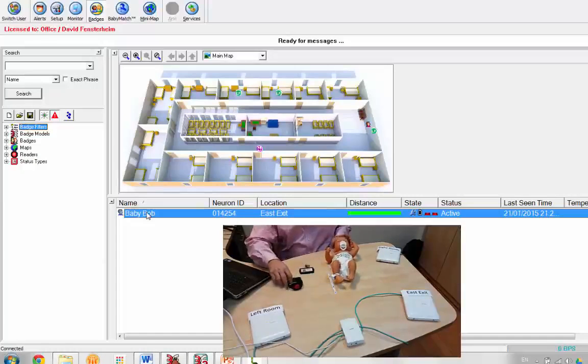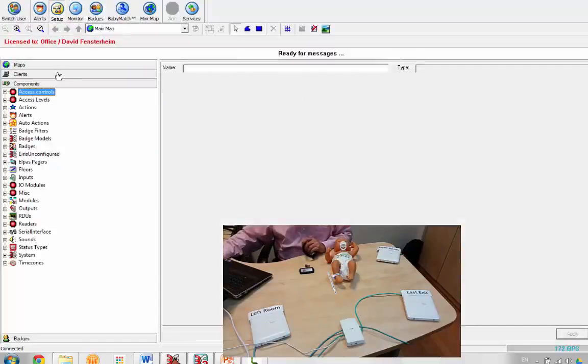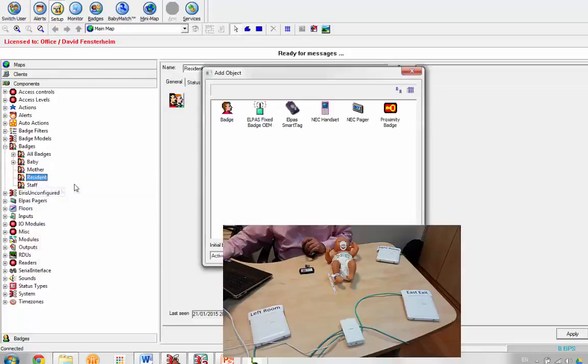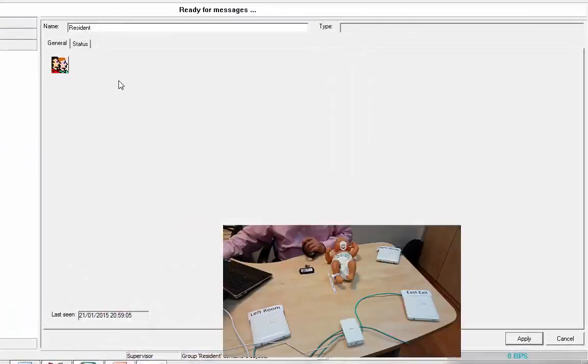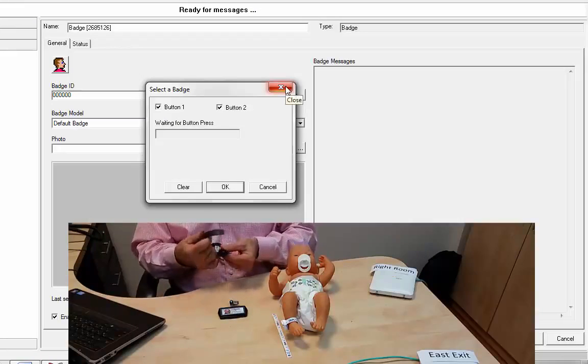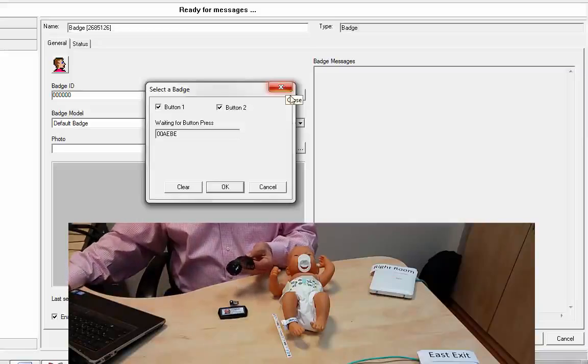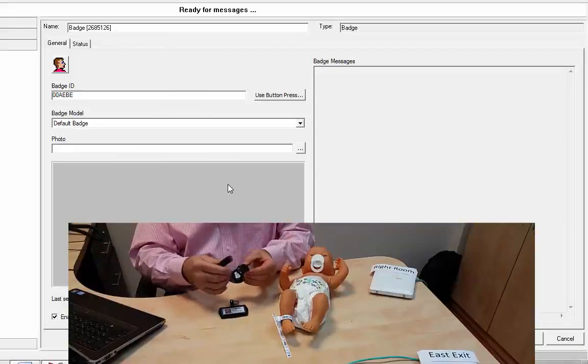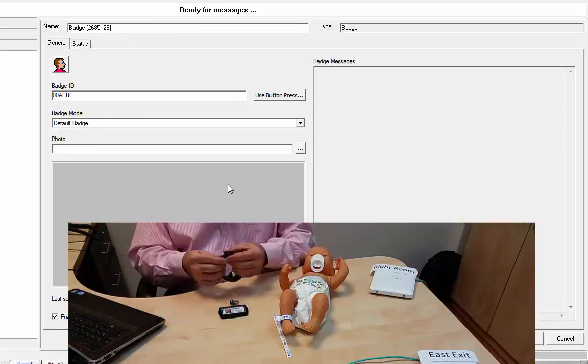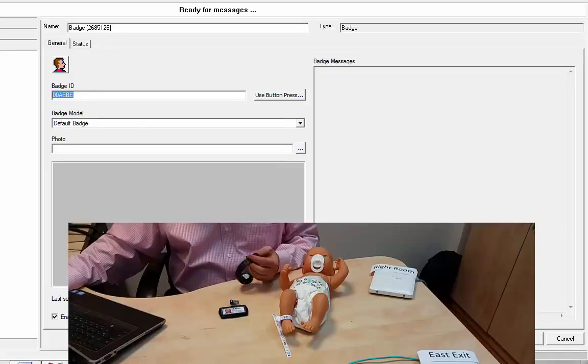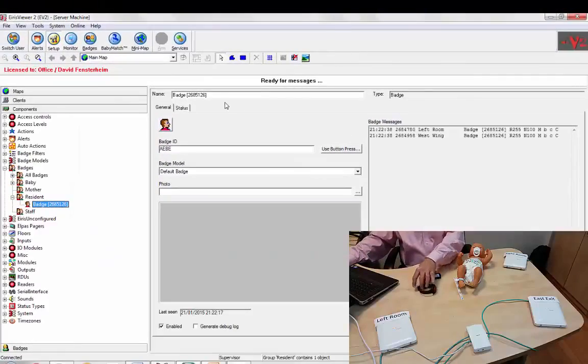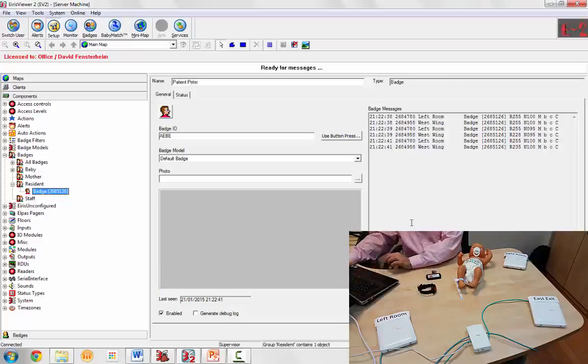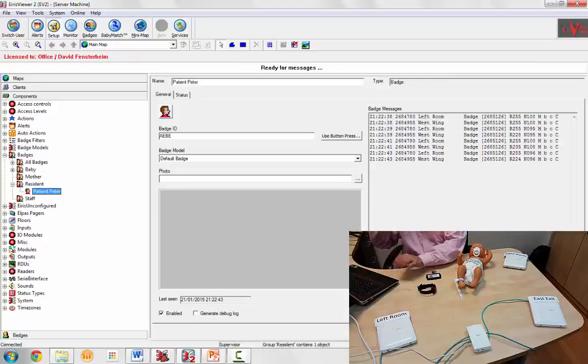And similarly, we can add our WANDER patient tag. Go to badges, and this time, we'll go to residence, add by type, badge, button press. We can either press the button, or we can do a tamper, meaning attach the band so that we close the circuit, and that transmits a message. We capture the ID, hit apply, give it a name, patient Peter.